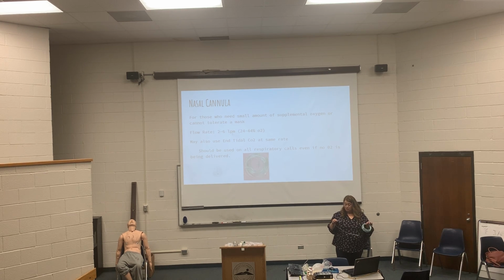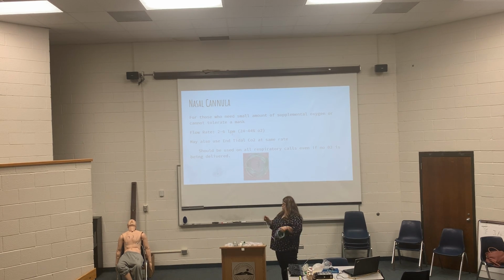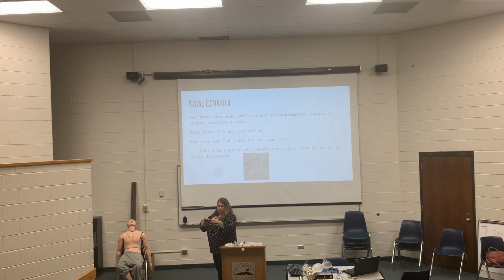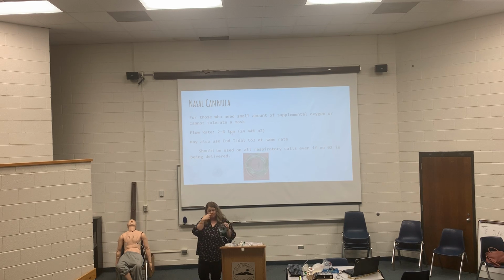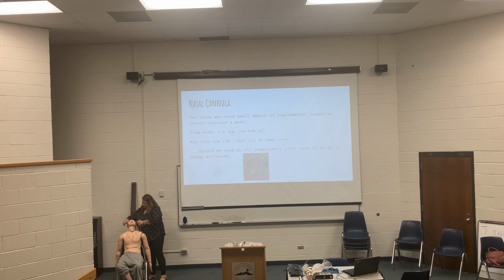But something, it's a pet peeve of mine that I want to instill in you guys is when you put this nasal cannula on, can you guys see these prongs right here? I mean, you guys have all seen this up close. Make sure the prongs are down, not up. Otherwise, you're just blowing oxygen out and not really up where they need to be. It goes up and it kind of hooks in there. I don't know if you can see very well from here. You put it on there and it hooks in that nasal notch, rather than if you were to put it up like this, it's pretty much just blowing out.